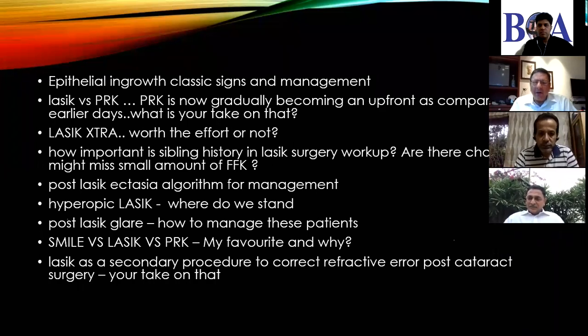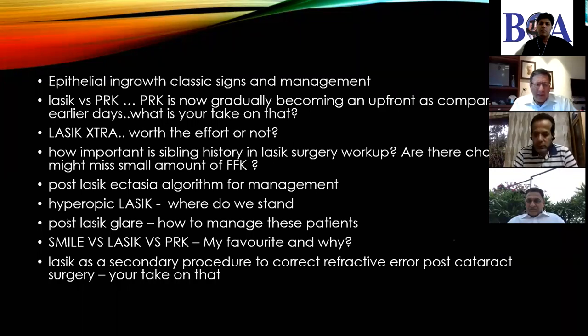So it involves a lot of hand holding. I don't think there's any physical thing you can do, of course. Do your topography, see whether you've decentered the treatment. If it's decentered, you can then recenter it with a Topolink LASIK, but otherwise precious little you can do.